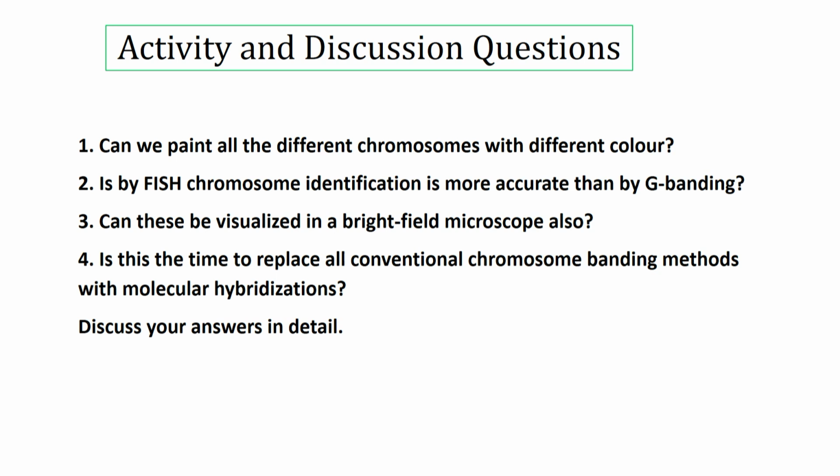I did say no. Always one has to be very clear on the aim, what we want. Do we want identification of all the different regions of a chromosome? Then no. If you want identification of one chromosome, yes. If we want identification of a gene within the chromosome, the molecular technique will be much better. So, these are the discussion points, and we should discuss in detail whenever time permits. I thank you.